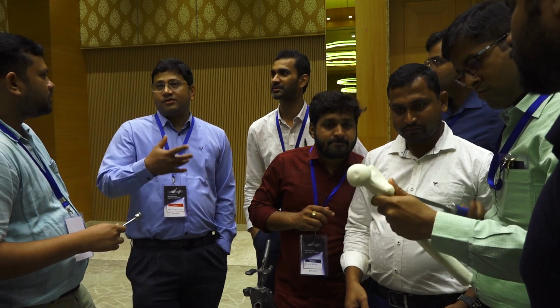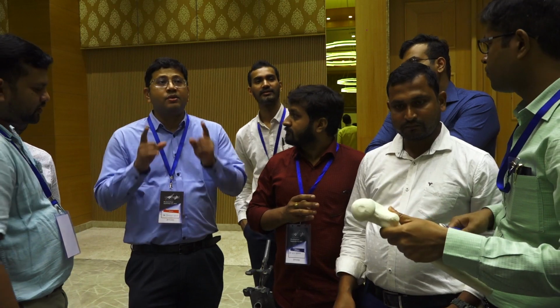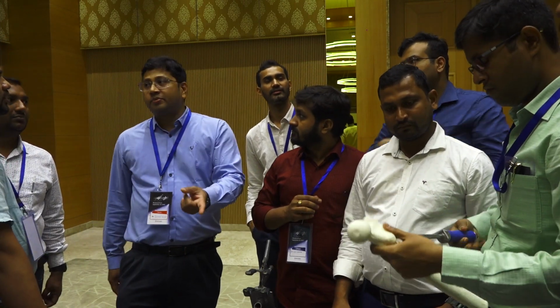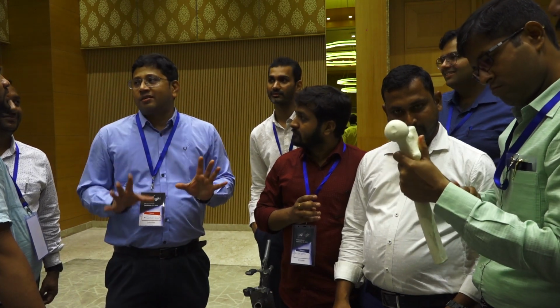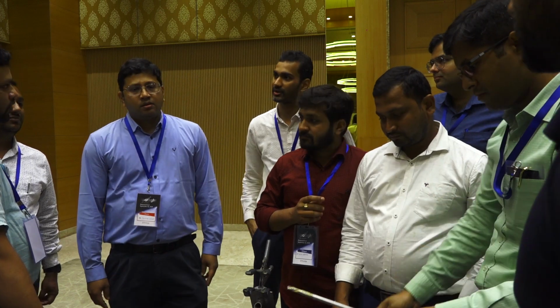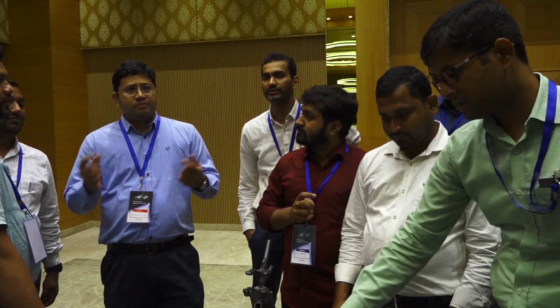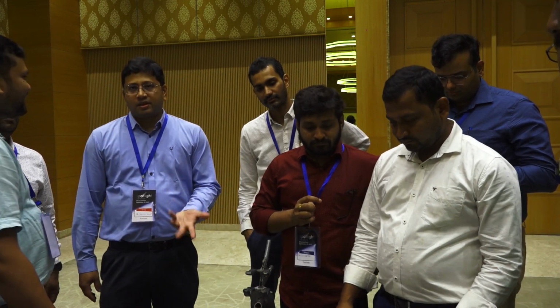No. There are certain scenarios where a very medically morbid, comorbid patient, you have got only one chance. You don't want to see the patient next time in the OT. I want to do one stem. Long stem, repair the GT. No short stem, long stem. Yeah, put a Wagner stem and repair the GT. Similarly, you can use a cemented long stem.